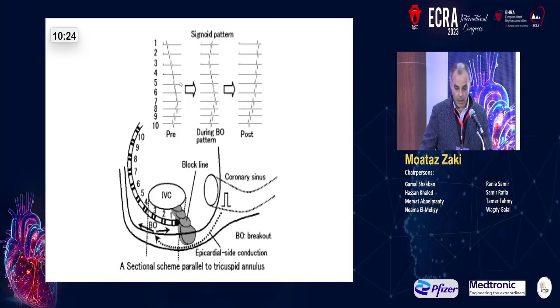So in this case, after we did the flutter line, that flutter didn't terminate and it kept going on in the counterclockwise direction. So we cardioverted the patient to elucidate the mechanism of the flutter. At baseline, you can see the chevron shape on the halo catheter denoting conduction across the cavotricuspid isthmus. However, after ablation, you can see what is called the sigmoid pattern.